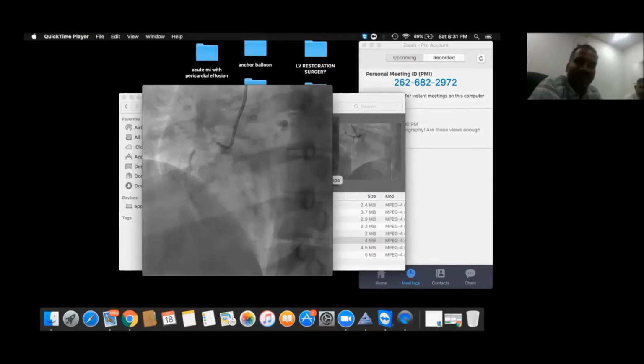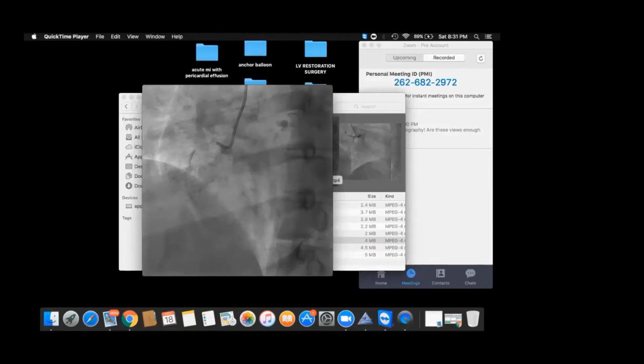Sir, can we come up with one question? Sir, what is the preferred diagnostic catheter of choice for SVGs to the left and right system, sir, through femoral? And how do you approach to locate the origin of the SVGs, sir?